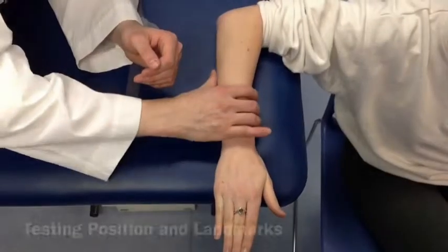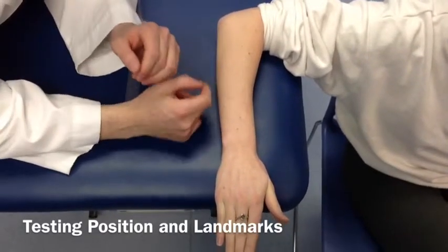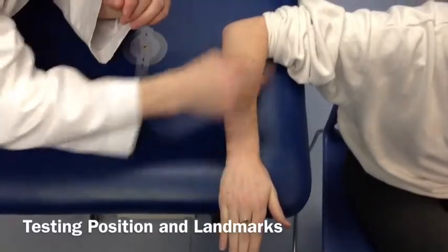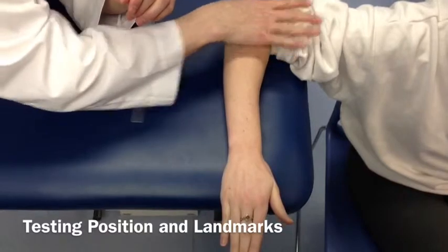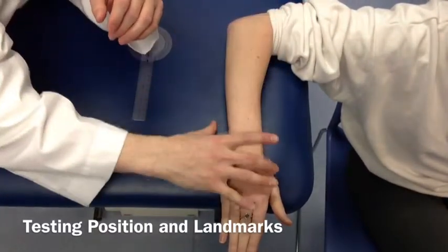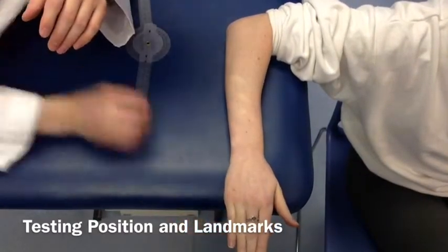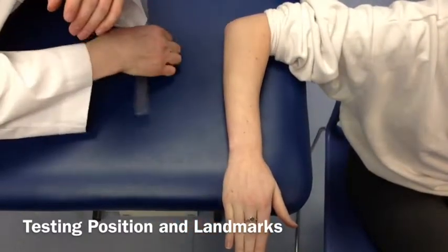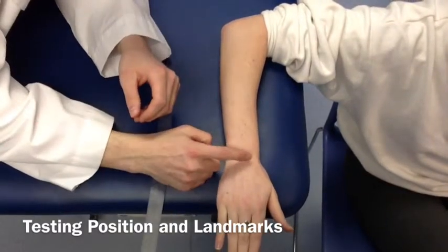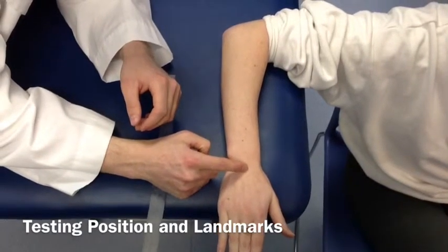To start off with measuring ulnar deviation, we're going to have the patient in a seated position with their arm at a 90-degree angle on the table, with their forearm elevated to about a neutral position. We're going to have the arm exposed for our bony landmarks for the goniometer. Our axis, or fulcrum, is going to be at the position of the capitate, which is the center bone of the carpal bones.